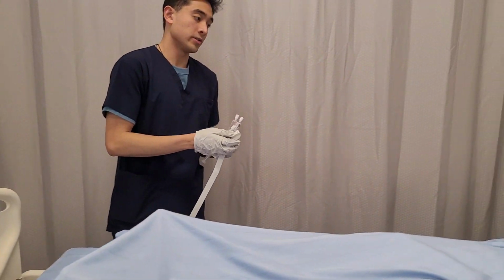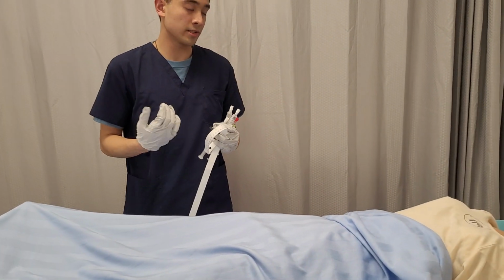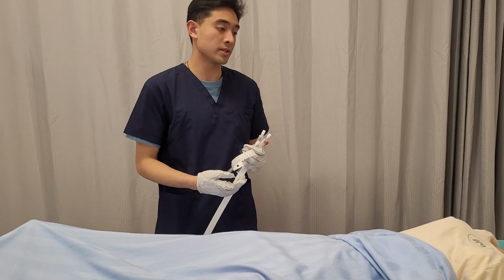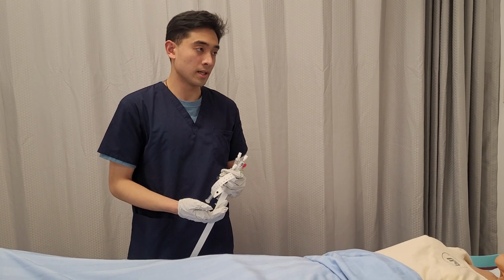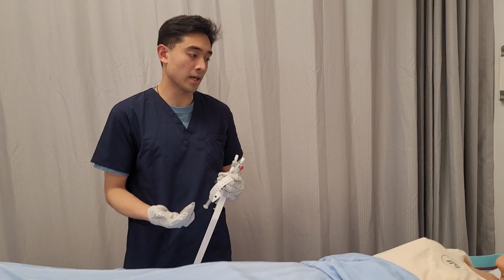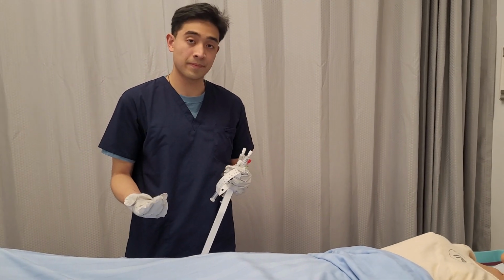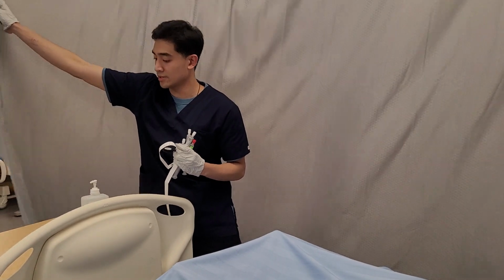So I'll introduce myself to the patient. Good morning, my name is Joshua. I'm a second-year student nurse from Camosun College. And so for today, I'm going to give you some antibiotics to treat your septicemia, which is a bacterial infection, if that's all right with you. Okay. All right, so I'm just going to provide some privacy over here. Just going to draw the curtains.